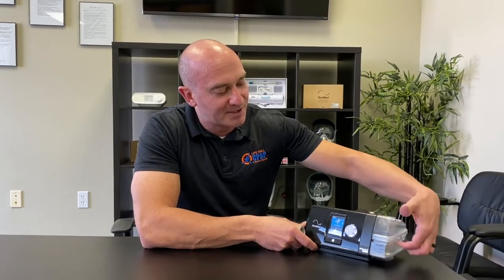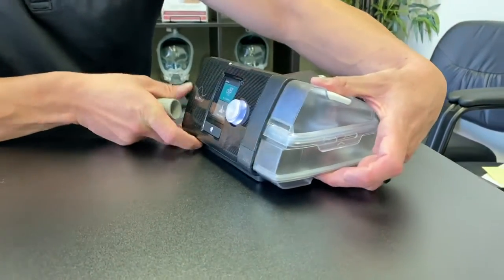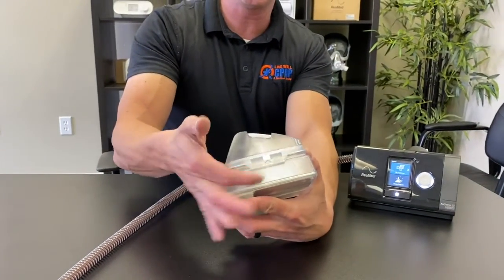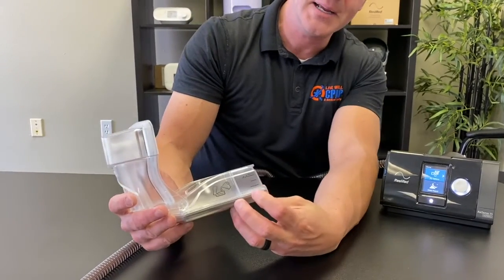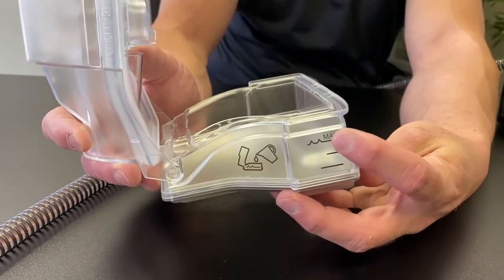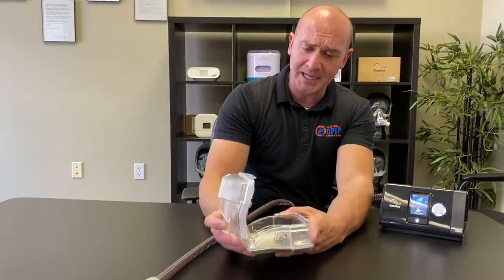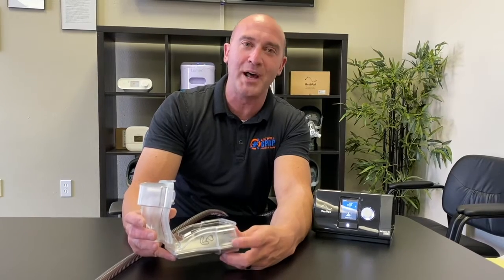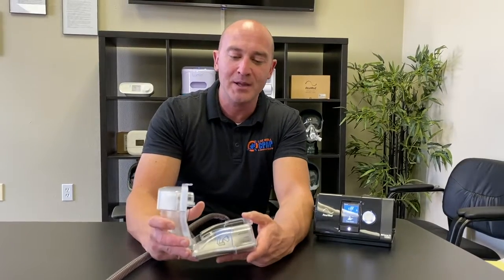First, we'll take a look at the humidifier for cleaning and utilization. To take your humidifier out, grab both the bottom and the top — you'll see it sandwiched on the side. Pull it out, then lift up on the tab to open it up. Fill it up every night to the max line. You'll notice this machine has more water capacity towards the bottom half, so the first half depletes faster — that's just the shape of the humidifier.